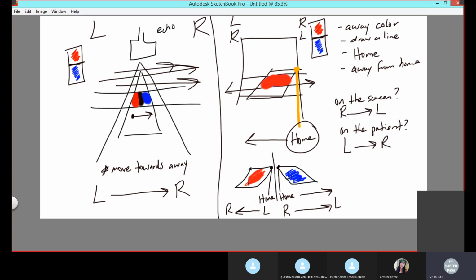Complete opposite answers. So please, please, please do not look at a vessel and assume what the color is. The key is to look at your velocity map. That is the one that tells you what things mean. I'm willing to bet my top dollar that if the color inside the vessel was pink, you're going to look straight for your velocity map, because you're going to ask yourself, what the heck is pink? And that's the way it should be with any color.